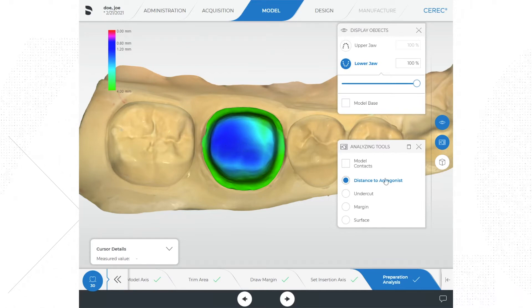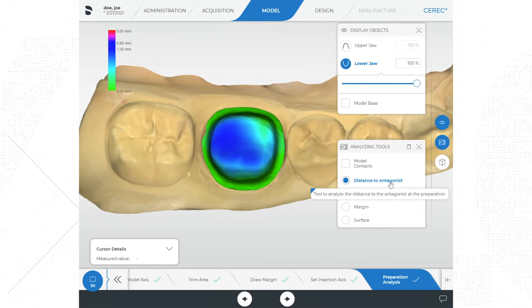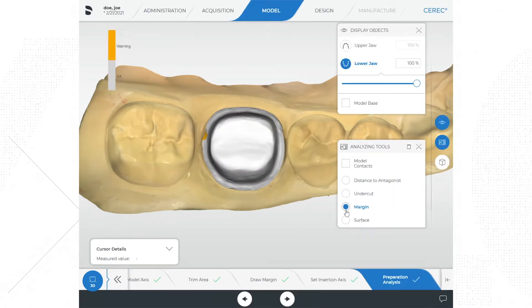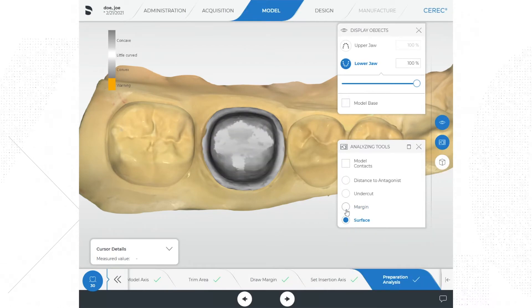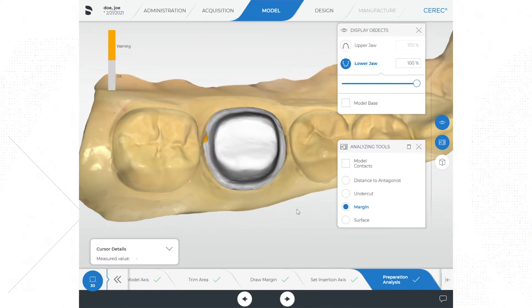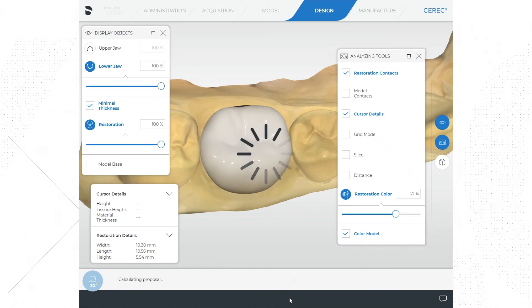Some other tools in this phase are within the analyzing tools menu found on the right side of the screen. When we first look at preparation analysis we are viewing the distance to the antagonist. We can also analyze the undercuts, the quality of the preparation margin, and the quality of the surface of the preparation. Use these tools to better understand your prep and determine if any changes could be beneficial. If everything looks good, go ahead and click the right arrow at the bottom of the screen below the step bar to advance the process forward. You can also click the design phase button at the top of the screen.